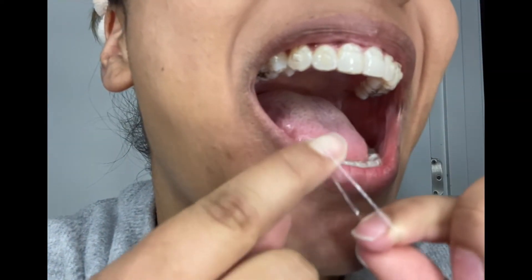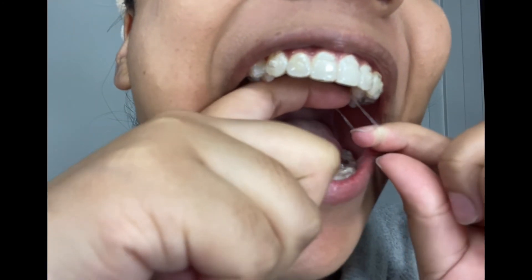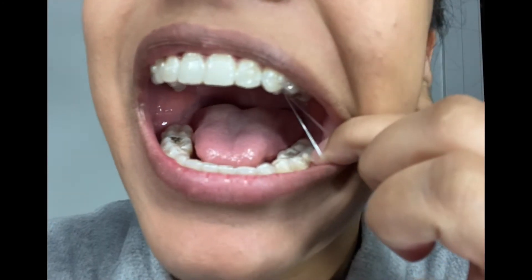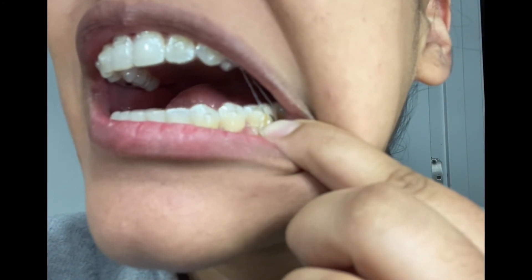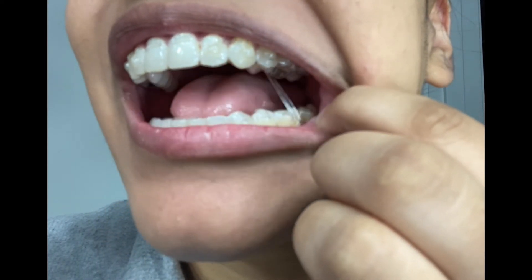Cross elastics will take some time to get used to. Start off by hooking the elastic on the upper tooth and then dragging it down to the bottom. Please note that on the top arch the elastic will be on the tongue side, and on the lower arch it will be on the opposite side.